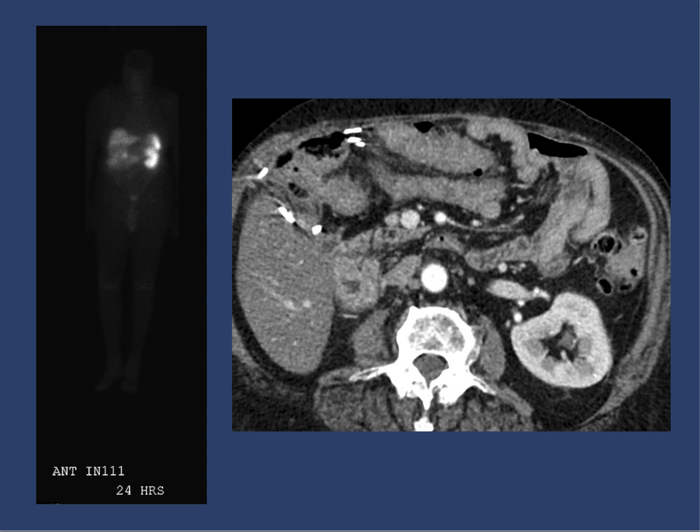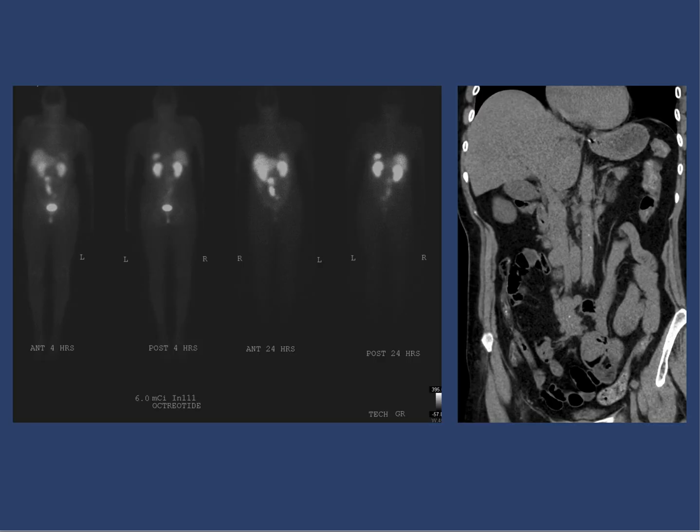This is another example where we see a really subtle neuroendocrine tumor. We can see it right here, and this is the lesion on CT. From what I recall, this is one of the pancreatic hormonally active lesions. This is another example where we see carcinoid tumor metastasis. Notice I'm not using the proper terminology, but we see these lesions on CT where, again, it's a mesenteric root mass, somewhat spiculated borders, calcification, and we see the lesions on the pentetreotide scan.